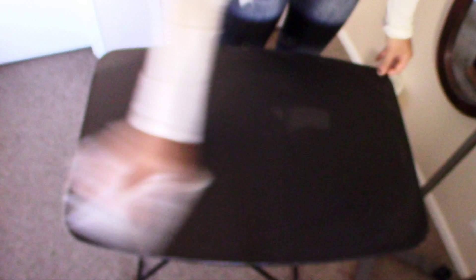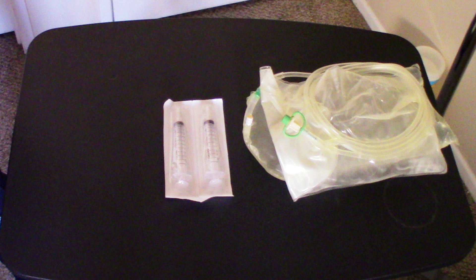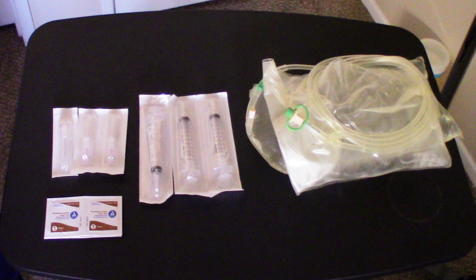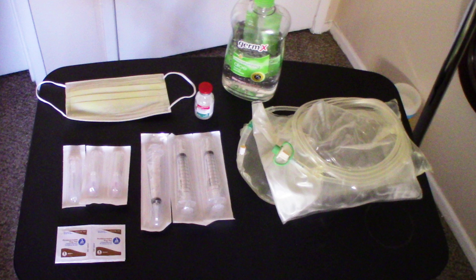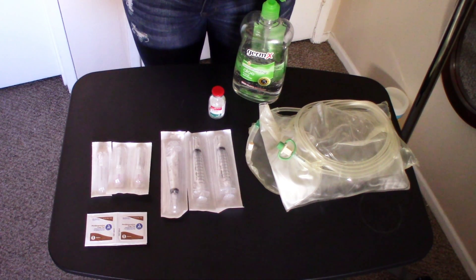Now we're going to grab our heated manual bag, a couple of syringes — maybe three, just in case — your needles, Povidone-iodine prep pads, your antibiotics or heparin, mask, and hand sanitizer. Now put your mask on and get ready to wash your hands.